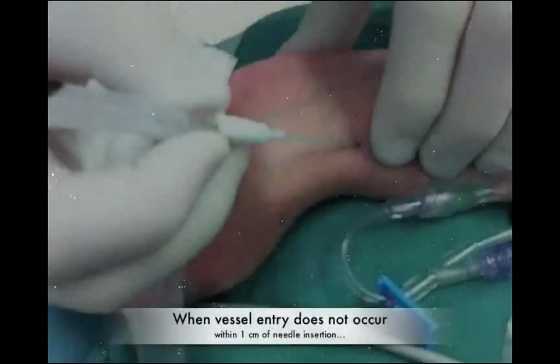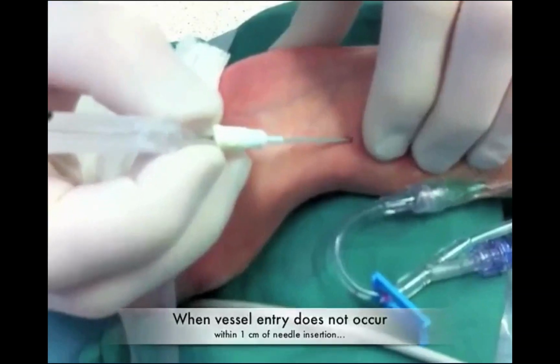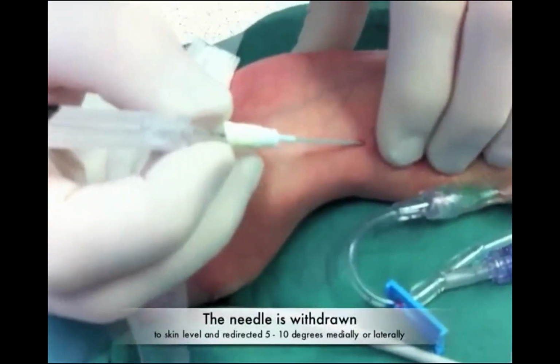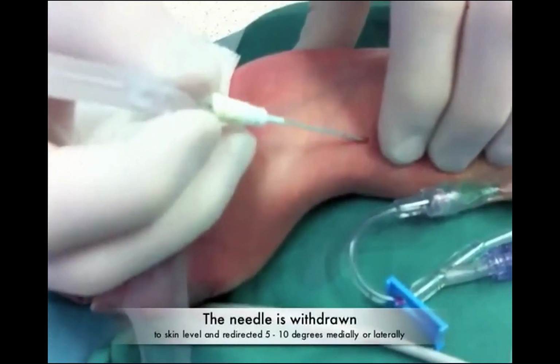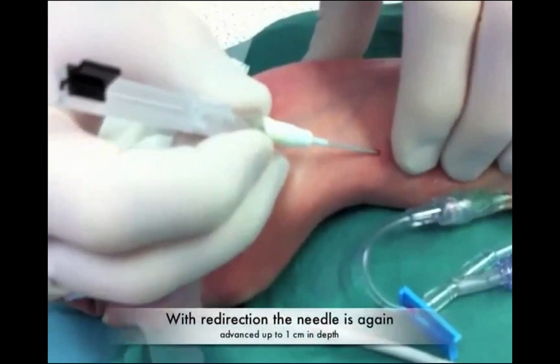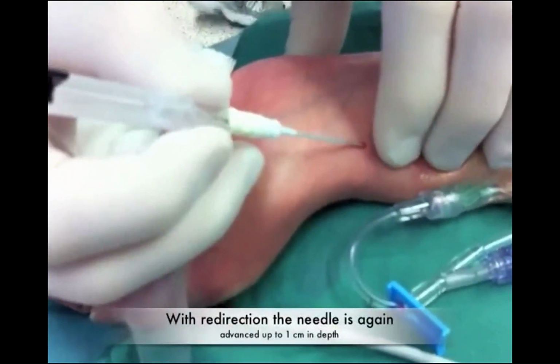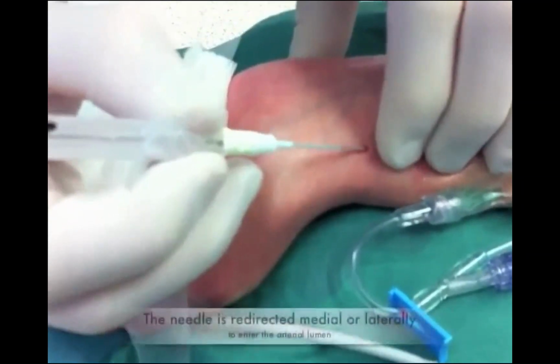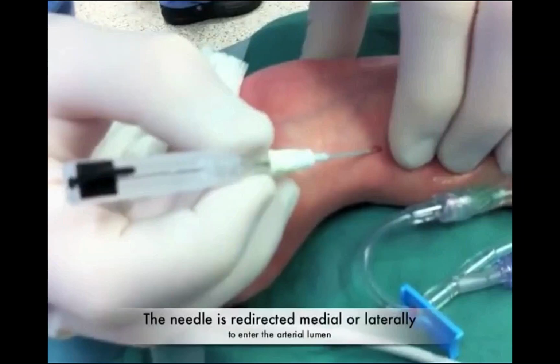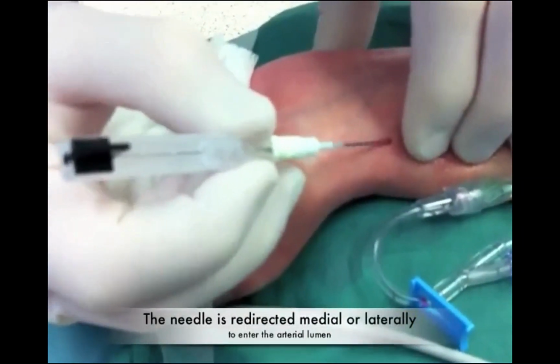It is essential to ensure that the wrist is properly extended. The point of insertion should be close to the radial styloid, as the radial artery will be superficial and immobilized by the wrist extension. A radial artery may be palpated more proximally, but it becomes much more mobile and difficult to catheterize. When vessel entry does not occur within 1 centimeter of insertion, slowly withdraw the needle to the level of the skin and redirect the needle 5 to 10 degrees medially or laterally.